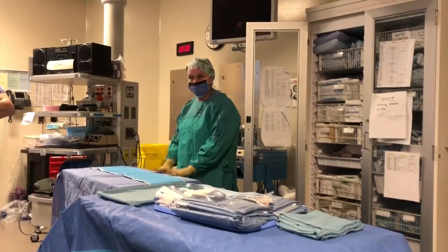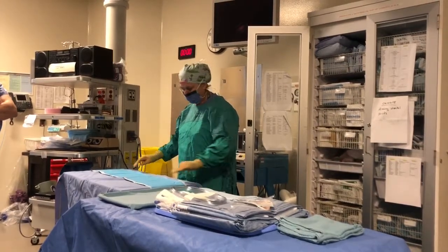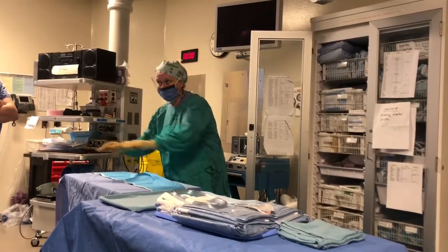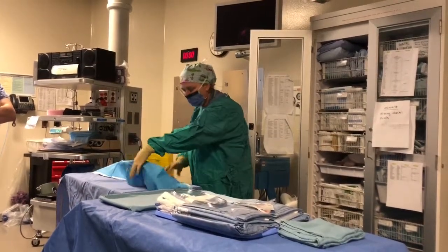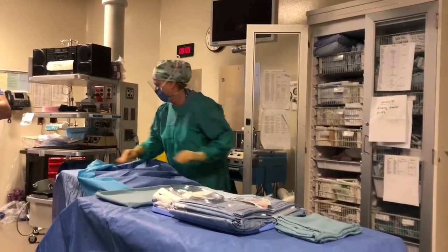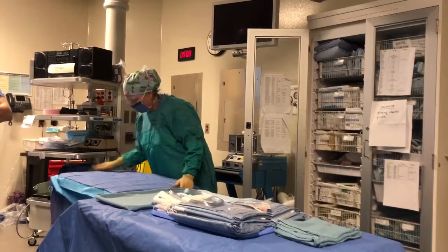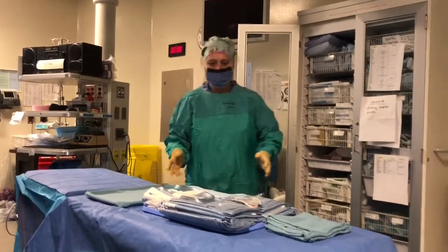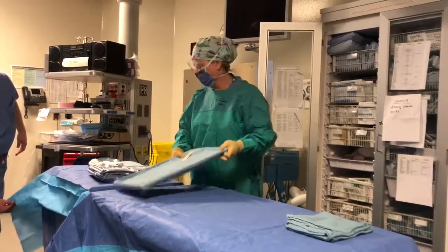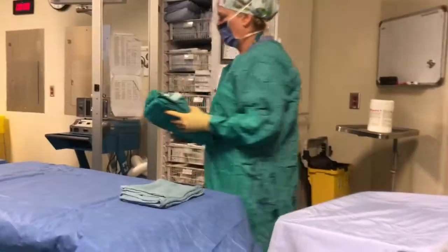If it didn't have anything on it, just a reminder, then this is not sterile, okay? That's when you would make sure you bring it to you first and then move forward and put it back. So you guys know all this. You guys remember all this, right? All right. So now I can take my whole thing. I can move it over. Okay? I can move this over.